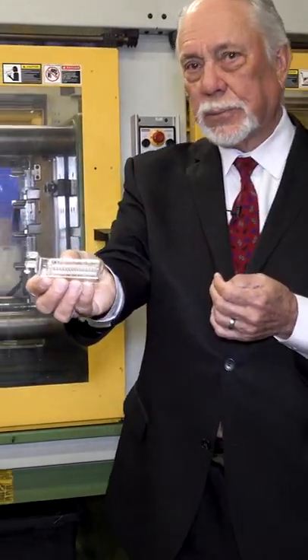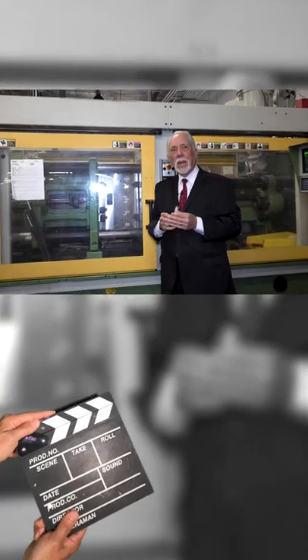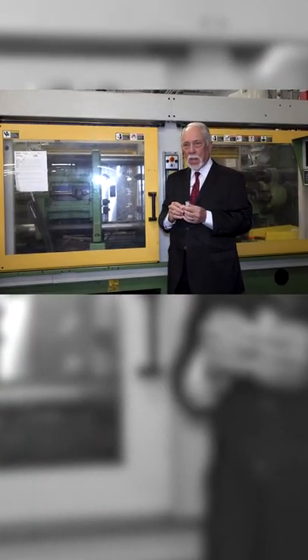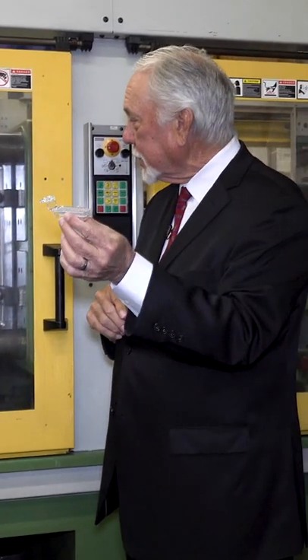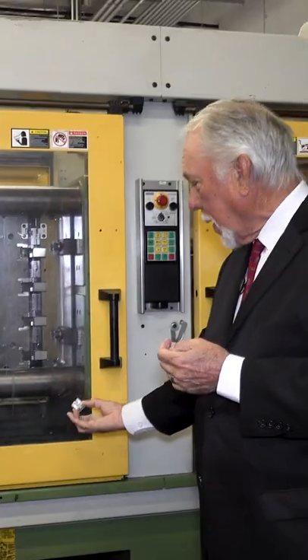That looks just like this here. Here we have what's called an Arburg plastic injection molding press, and it will make parts like this, which are little dental articulators. It cycles about every 20 seconds or so — they just fall out to the bottom.